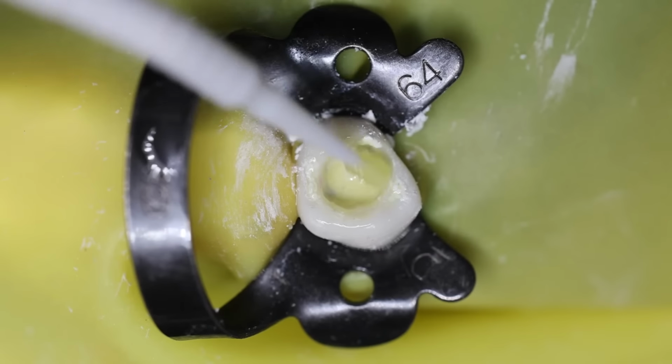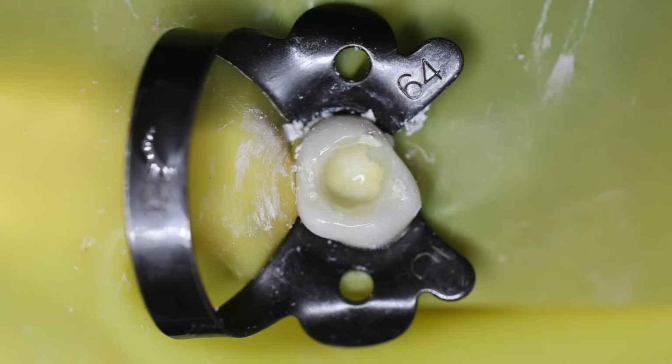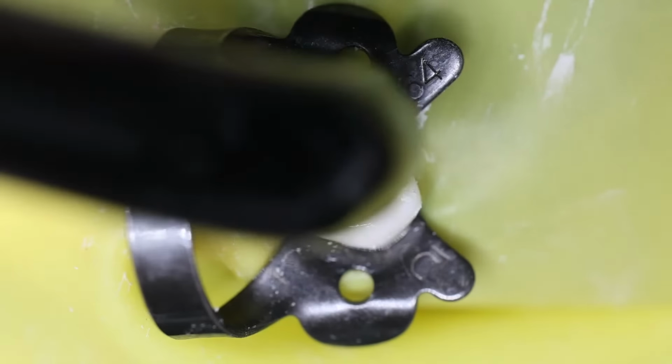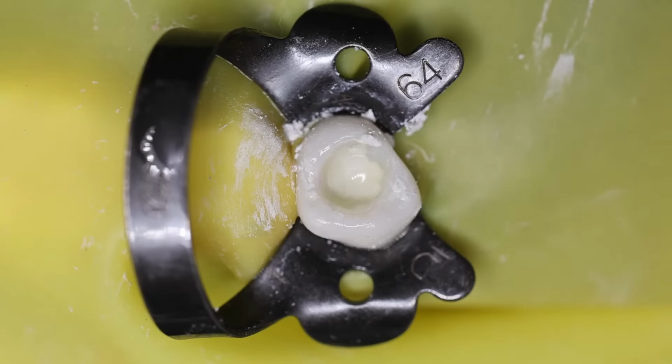Okay, once you apply the bonding agent, cure that bonding agent 20 to 30 seconds. After curing for 20 to 30 seconds, now you can proceed with the restoration.